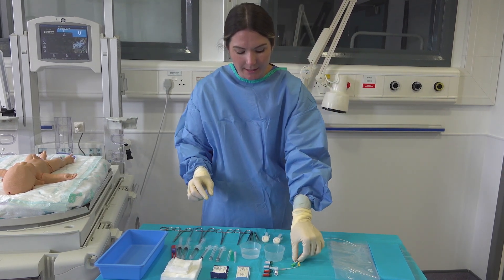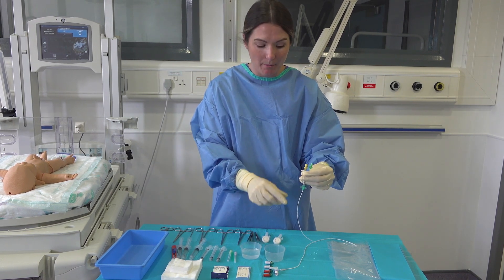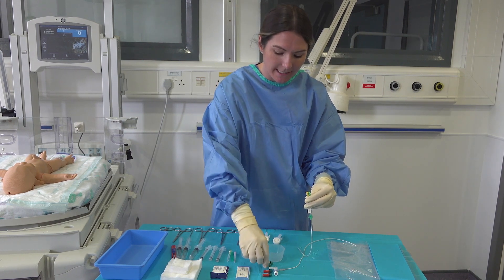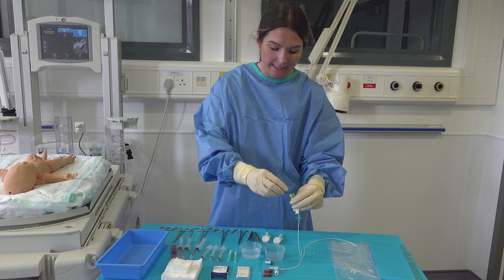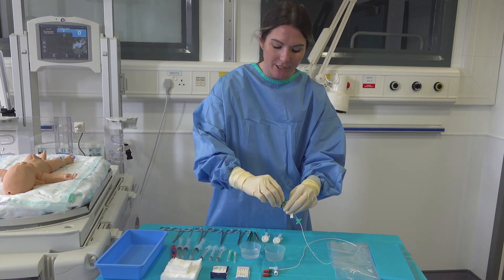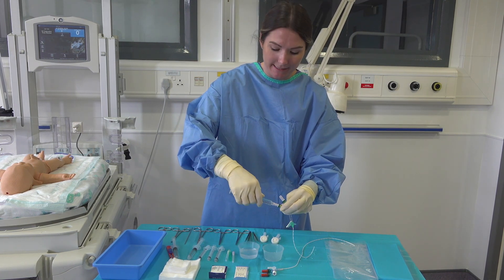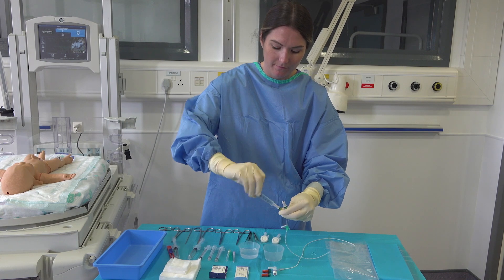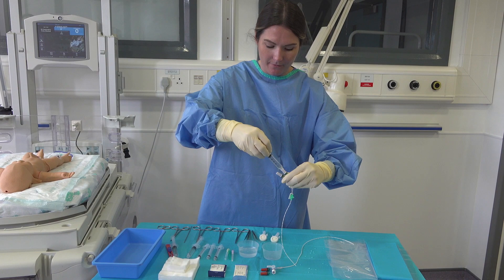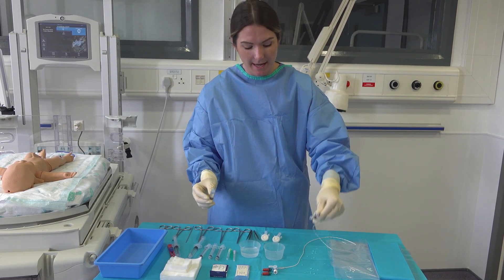Now I'm going to take my UVC, making sure that none of the sterile parts touch anywhere else apart from the sterile drape, and I'm going to put on the Venous luer locks. One goes on to each end and then I'm going to prime the lines, making sure that it's coming out the other end to ensure no air bubbles are in the line.